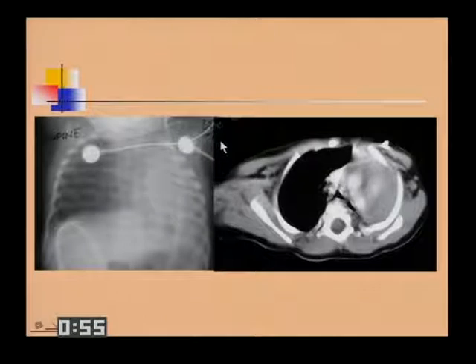You can have unilateral pulmonary agenesis. It's usually associated with agenesis of the pulmonary artery. It's a diagnosis of exclusion. You would be looking on a CT to follow the tracheobronchial tree down to look at the pulmonary artery. It's sometimes seen in association with abnormalities of the vertebral bodies.